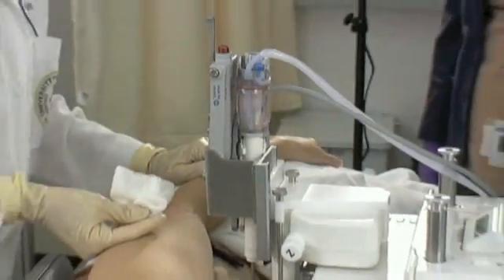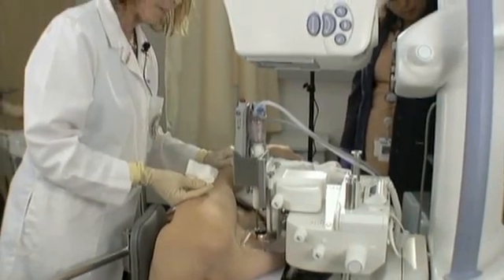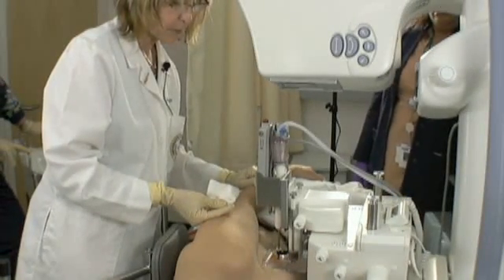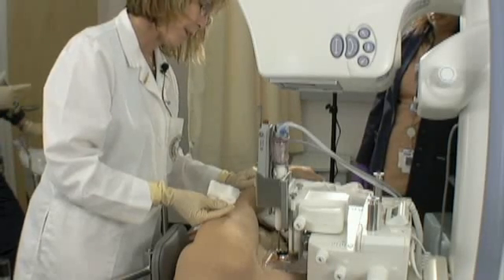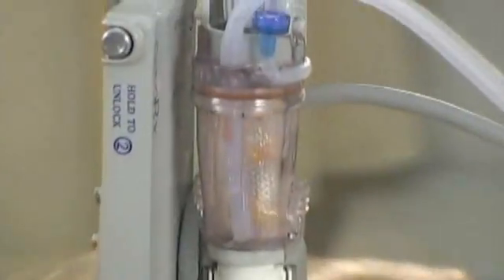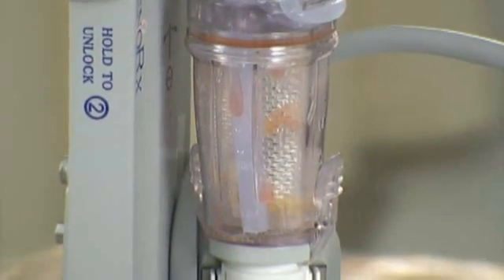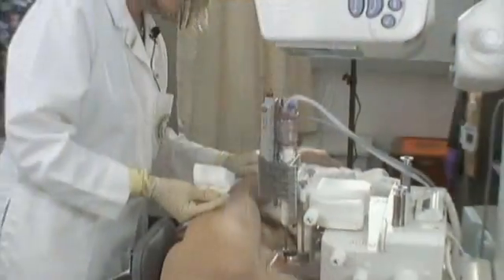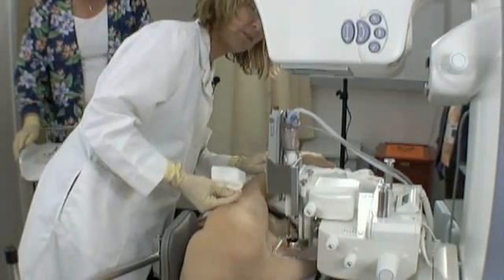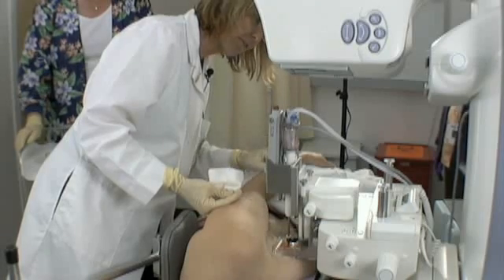Initially the needle goes around the even numbers — it starts at 12, then 2, 4, 6, 8, and 10. The second time it goes around, it goes at the odd numbers. We sample every clock position, taking 12 samples as a standard case. The samples are also washed as they're collected, and the effluent is taken away by another vacuum. We then vacuum the area where the samples were taken to get rid of any tissue in the chamber and take care of any heme at the site.